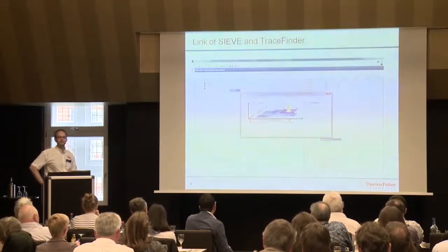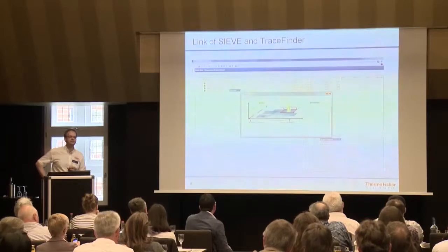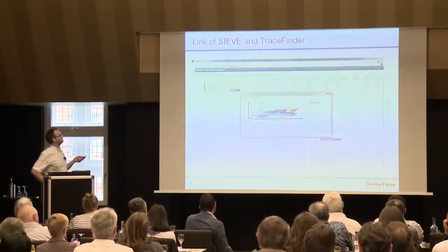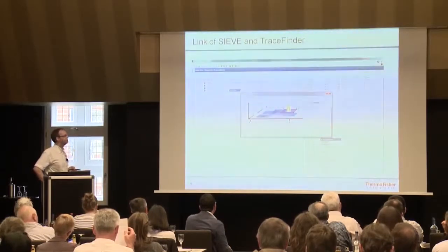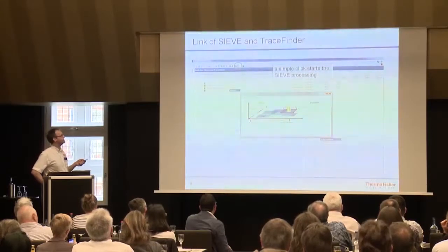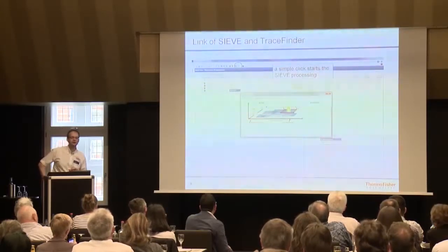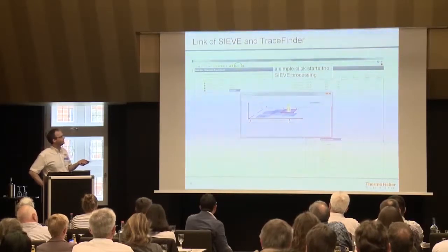We are still working with TraceFinder, and we are still taking, this is still the set of 4 samples. I'm still sitting on the same sample set, which I just used for this screening approach and semi-quantitative approach. I just now click a little button up here, which leads me into the software Sieve, which is installed on the computer the same way. And then this pane opens here.